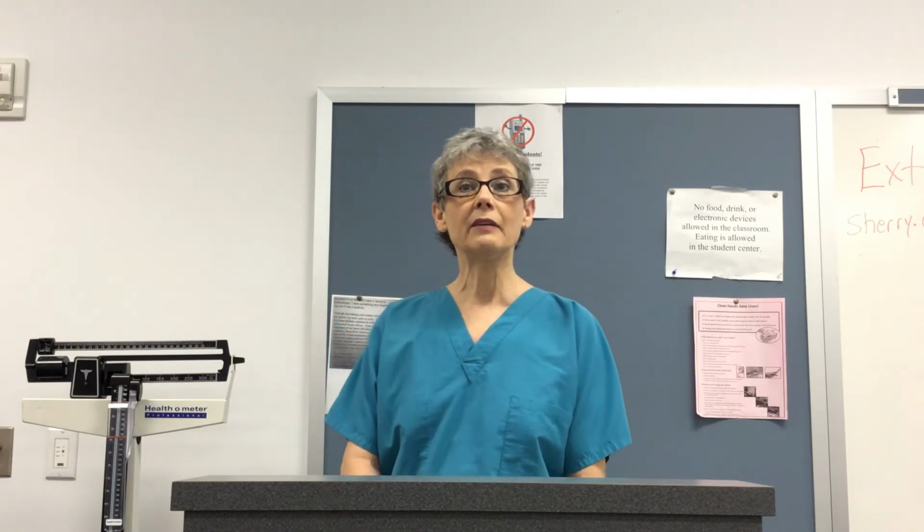Before you start the IV, continue to look in the chart and see if there is a surgical procedure or maybe a radiology procedure. Sometimes these procedures require a certain size of IV that needs to be put into the arm. But of course, remember this, if you only have a little small vein, you can't put a big IV in. Your IV catheter matches the size of the patient's vein.